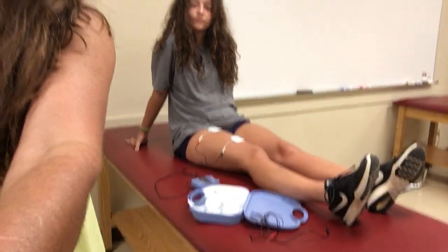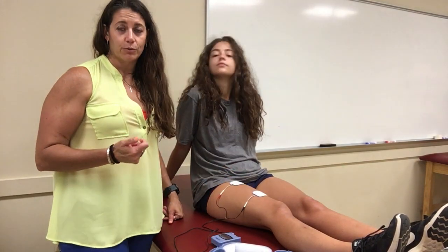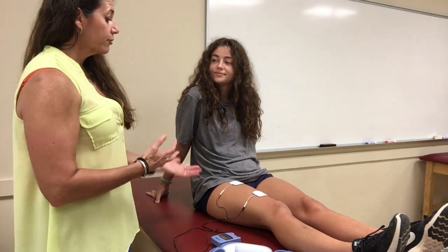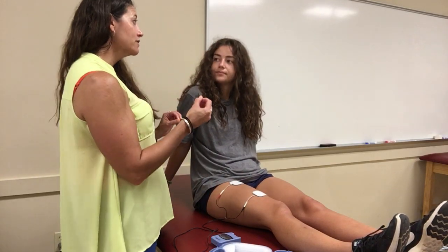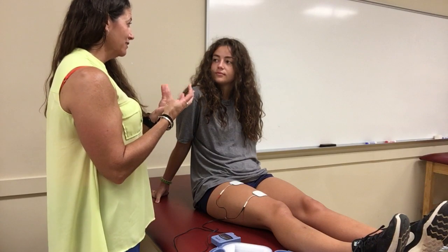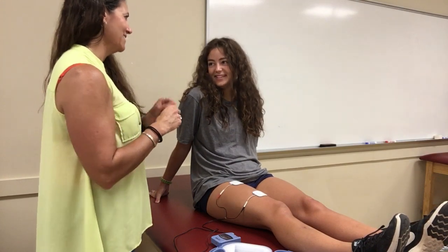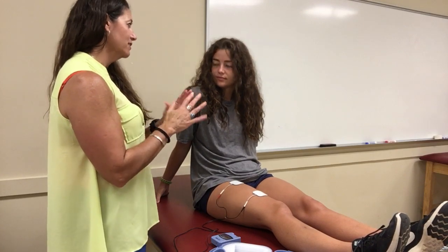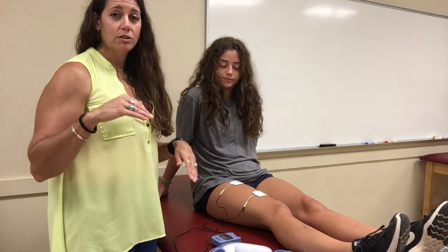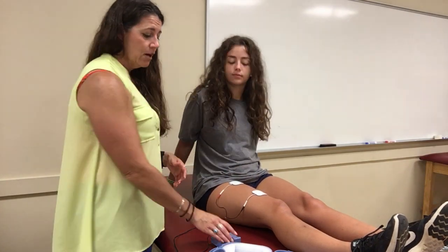Think about that as you're applying electrodes for these treatments. When we're treating pain, all the patient should feel is some tingling — it could be a strong tingle, but as soon as muscles start jumping, that's too much. Tell them to say something as soon as they start feeling it, and once it gets to a strong tingle, that's enough — that's the most they should feel. They should not go beyond a strong tingle. If their muscle is bumping, you've moved to a completely different setting than what we're doing here for pain.